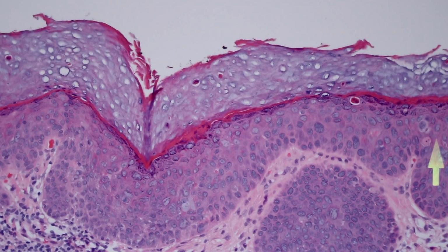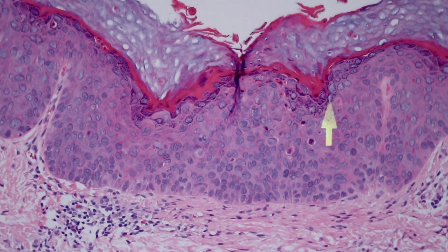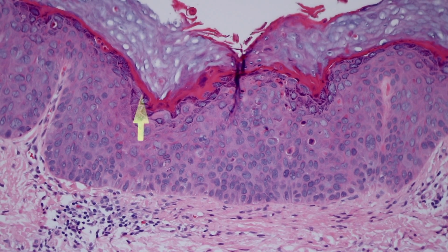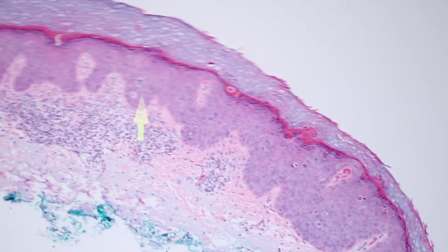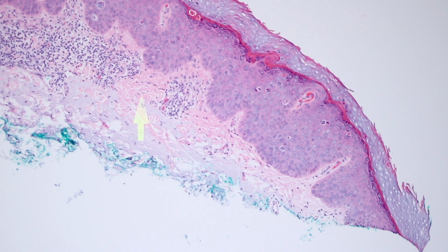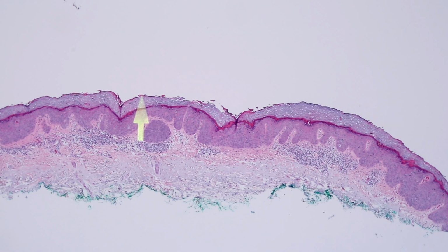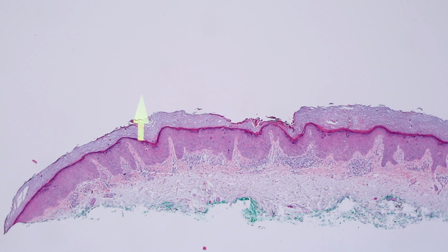So this is a very, very subtle squam in situ, I think, and I feel like it takes a while to recognize these. And look at the top, it almost looks, to me, it starts to remind me a little bit of like koilocyte change, kind of. Again, this is one of those that has very much an HSIL, HPV look to my eye, and I don't report, I just call these squam in situ. I don't know what that means, but I do see some that really have that HPV sort of look, even though they're away from the anogenital area. So I think these are easy to miss, and I've seen ones that actually from low power look kind of like psoriasis. They had an elongated, reedy, psoriasiform look. This one doesn't really, but I've seen ones like that where they're really thin and really subtle, and those can take a little bit of practice to recognize.